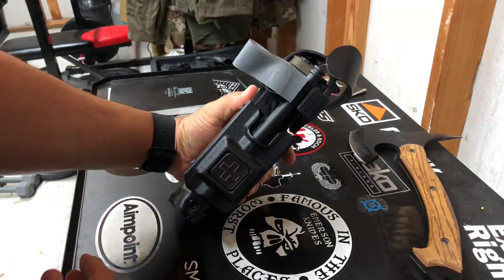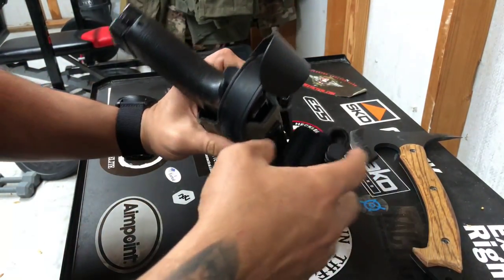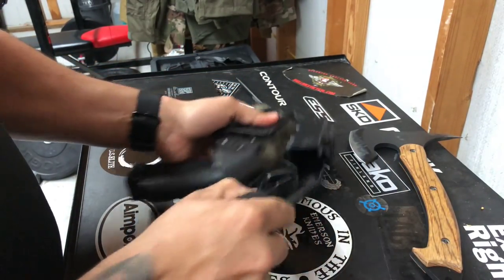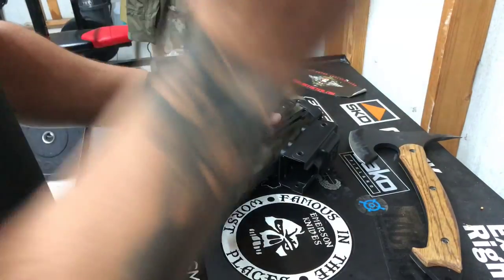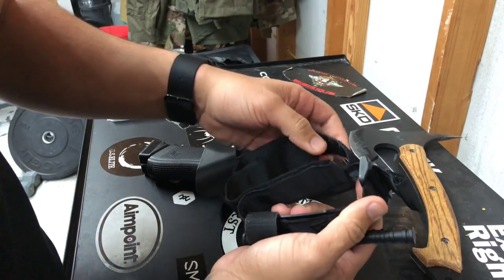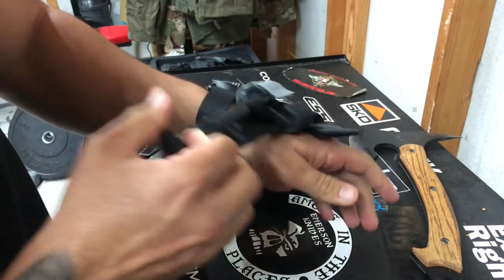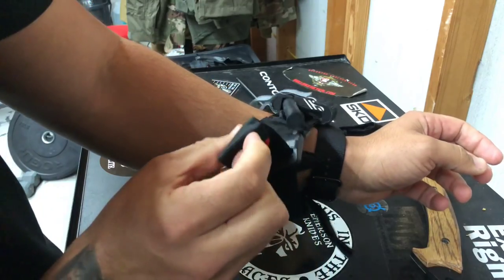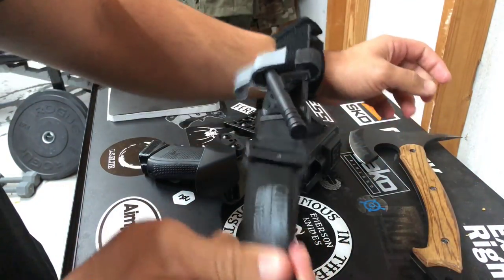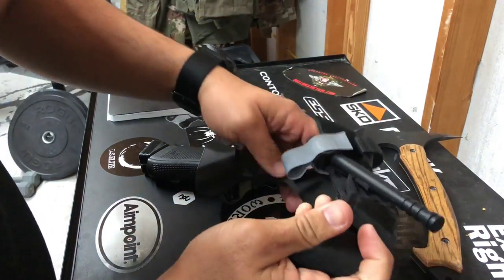That's all I have in my tourniquet pouches just like that. If I need to deploy it, all I have to do is grab it, pull it out, and flake it open just like this, then throw it over whatever extremity I need — arm or leg. Because this piece is not Velcroed on the other side, it's a lot easier to grab. All I have to do is pull and then you guys know the rest.